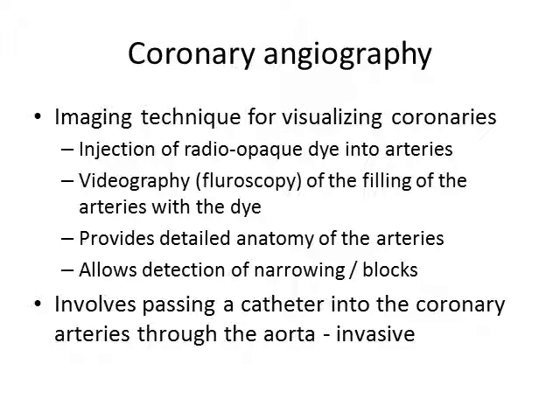In other words, a fluoroscopic videography of the coronary arteries is performed as they are being filled with a radio-opaque dye. This procedure provides a detailed anatomy of the coronary arteries and also helps in detecting narrowing or blocks in the coronary artery. This procedure involves passing a catheter into the coronary arteries through the aorta. It is therefore an invasive procedure and has to be performed with appropriate precautions.